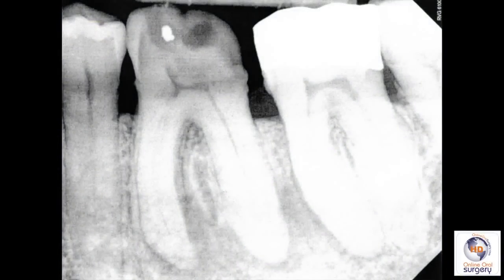Here's a periapical radiograph of the tooth, and you can see that there's fairly extensive decay and widening of the periodontal ligament space around the root, especially into the furcation area. So this tooth has a pretty poor short- and long-term prognosis, which is why the endodontist recommended extraction.